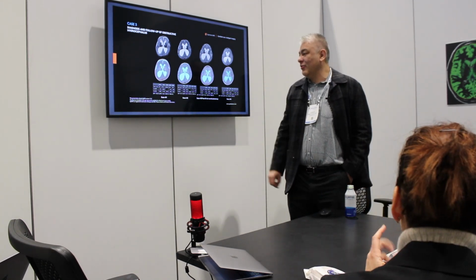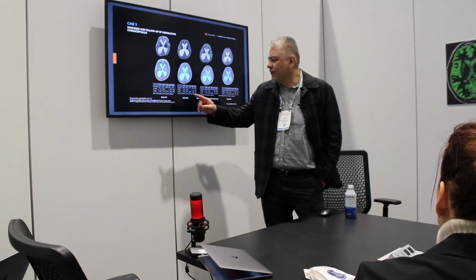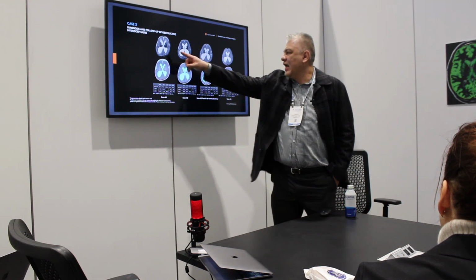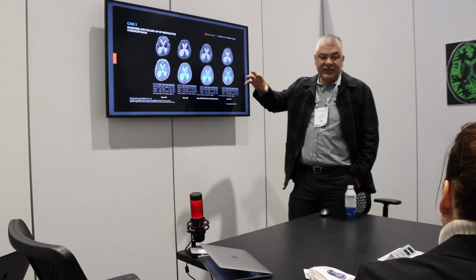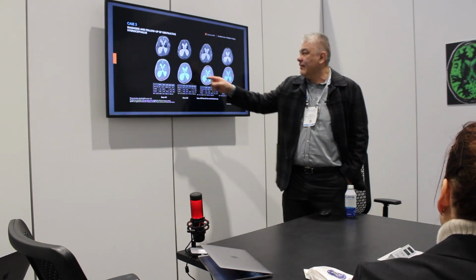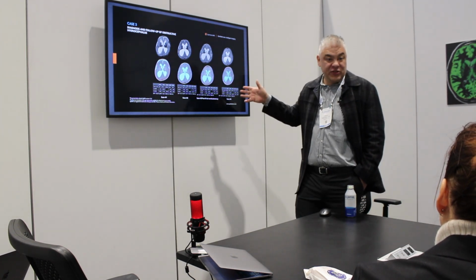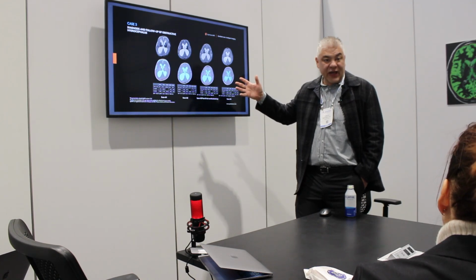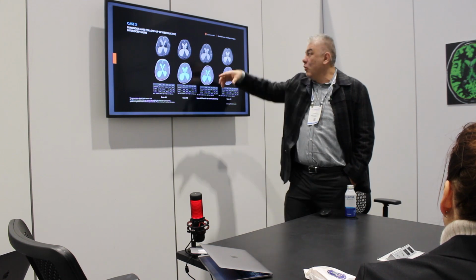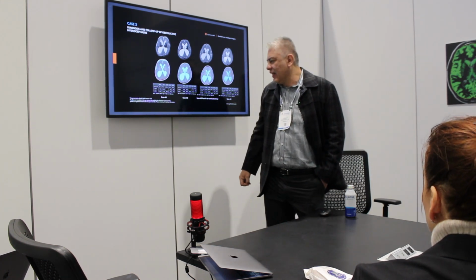But you have other volumes too, right? Yes. For example, you also measure that the brain becomes bigger when it starts myelinating more. So when you do follow-ups over time, you don't follow over a day, you follow over months sometimes. If the myelin progresses, you can be filling up more extra-axial spaces.